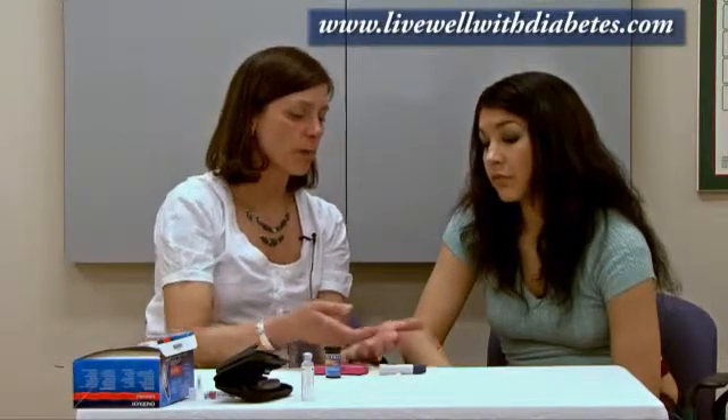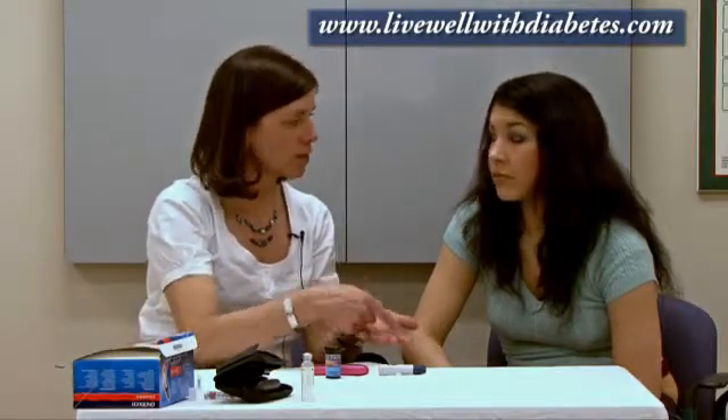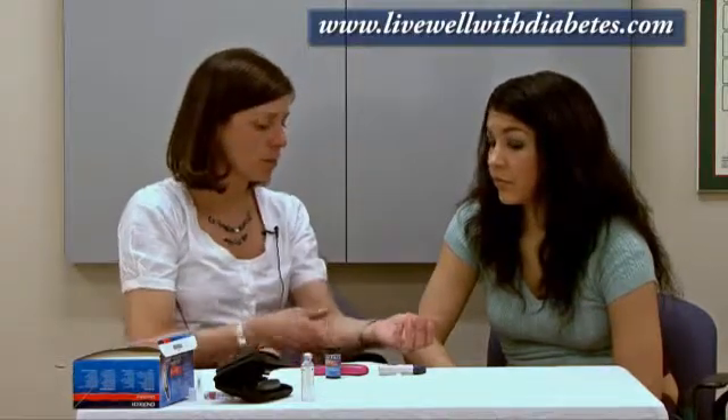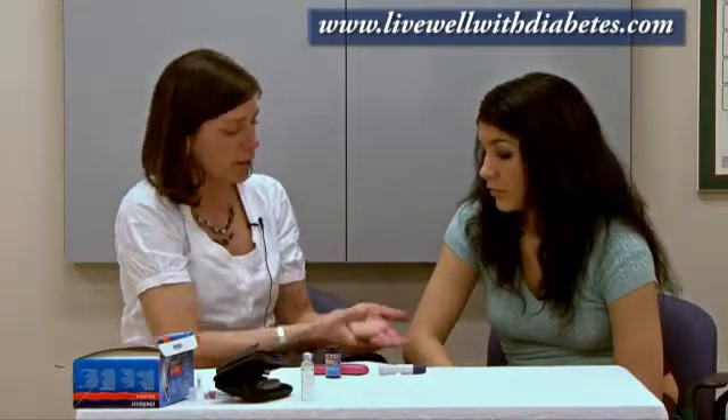One of the biggest problems some people have is they poke their finger and don't get enough blood. When you're ready to poke the finger, some people shake their hand — when they shake it, their fingertips get very pink and the blood goes down towards the fingertips. Alternatively, another person might push the blood down from the elbow area all the way down to the tips of their fingers until their fingers get very, very pink. Preparation helps a lot.